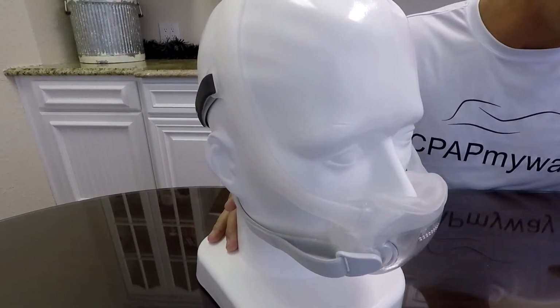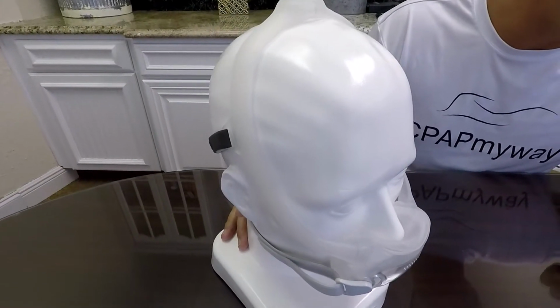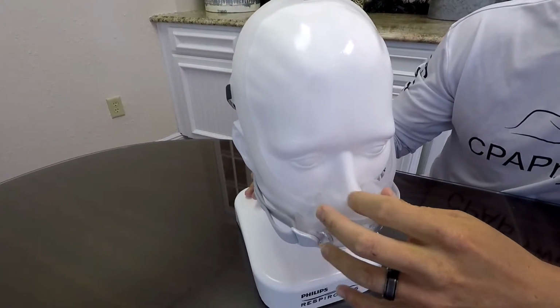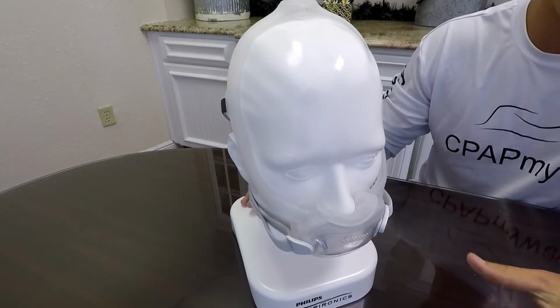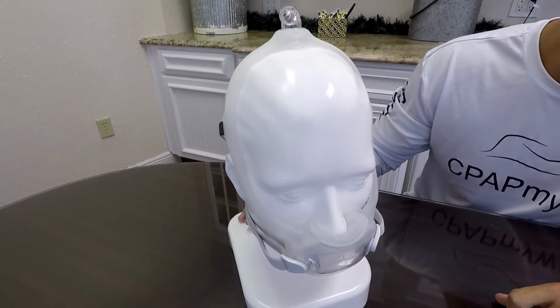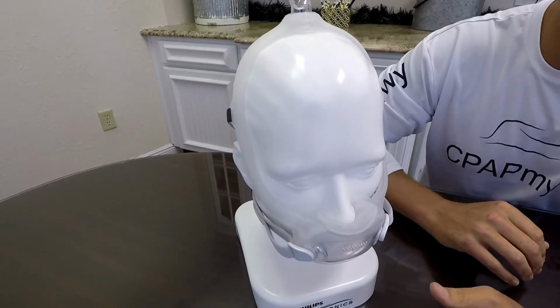It's definitely the more modern of the styles, and most of the new masks that are coming out are in this kind of style. The only issue that we have from time to time is that it has some tendencies to leak around the edges of the nose. If that happens, we usually recommend downsizing. This happens to be a large, so you may want to downsize to a medium or medium to small if you're having that issue.